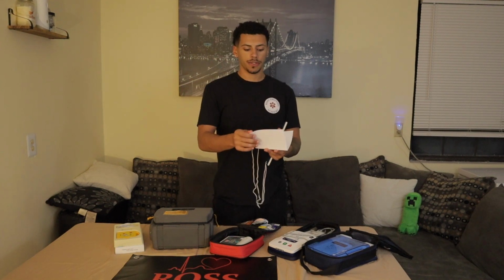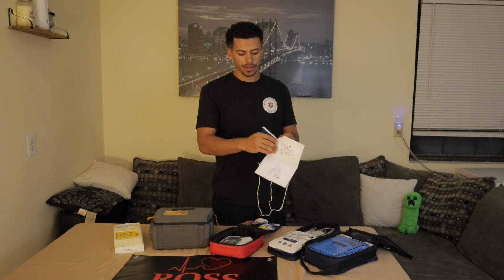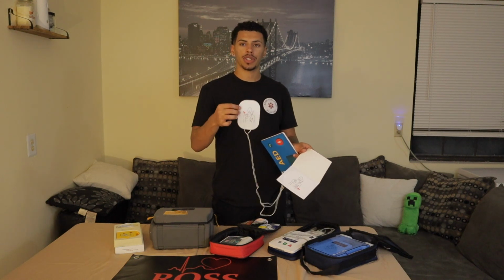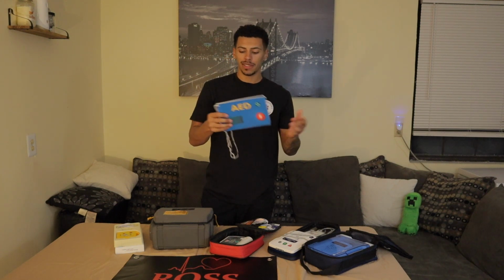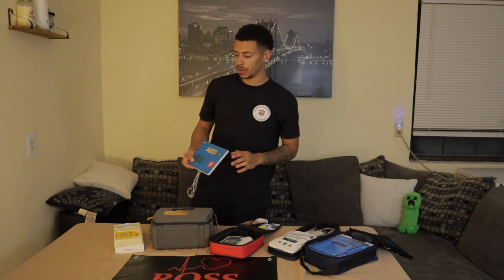Then we'll flap this open, and you see they're basically stickers. They're sticker AED pads, but they still have the little diagram to show you exactly where to place these stickers on your patient. So there's really not a whole lot to say about this one. It doesn't do anything. It just shows you where to place the pads, and that's about it. So we're going to move on from this one.